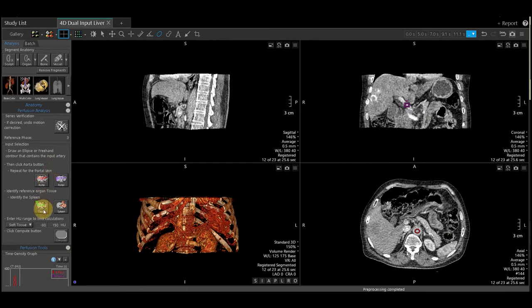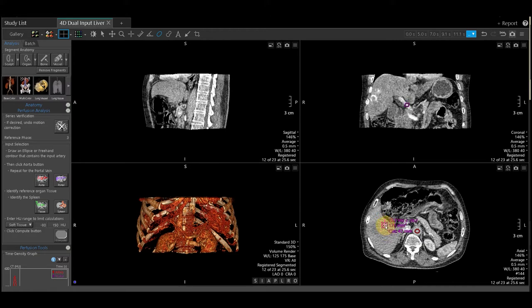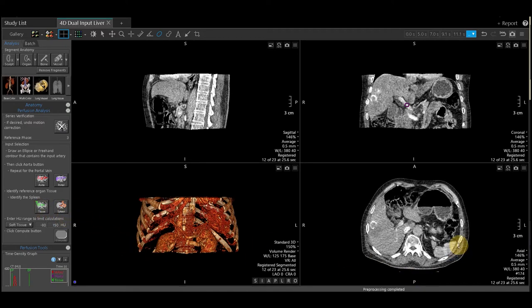Going further down the page, we need to do the same thing for a reference organ tissue, which we will do in the liver and the spleen. You do want to make sure there is contrast in those organs as well. Hold left mouse down and draw a region of interest. You do want to make sure it's in healthy liver tissue. Then scroll a little bit more to put one in the spleen and select spleen.